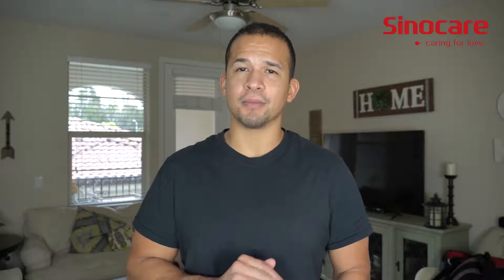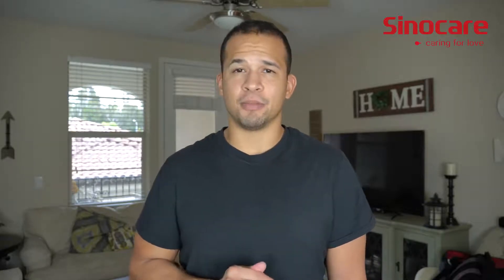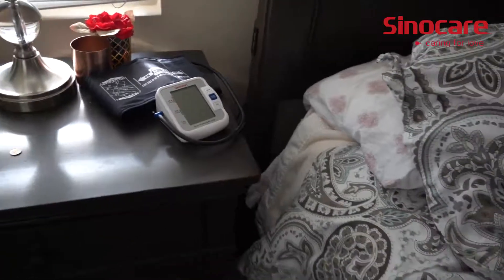This is an FDA approved blood pressure monitor and it's the most convenient one you'll ever find. On top of being super convenient, easy to use, and small enough to tuck away anywhere, it also has some really awesome functionality.